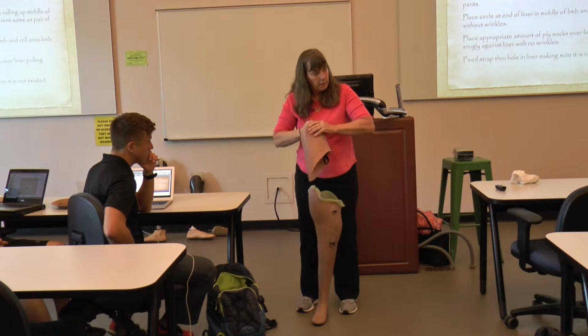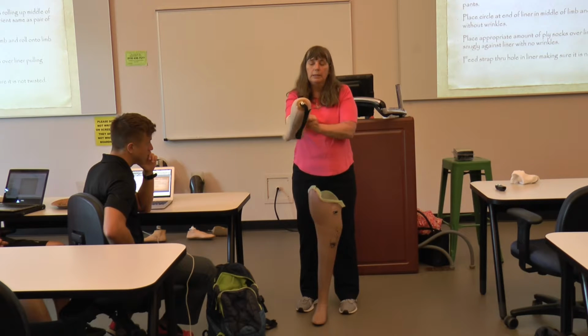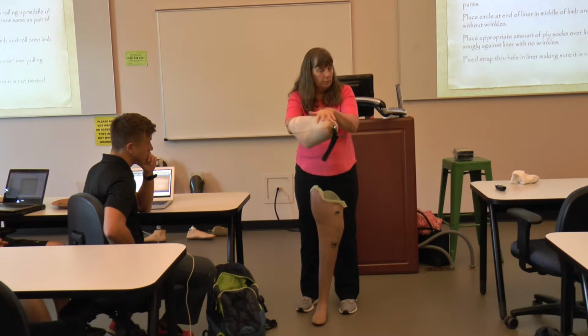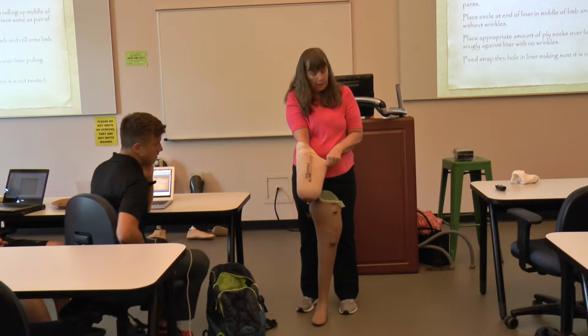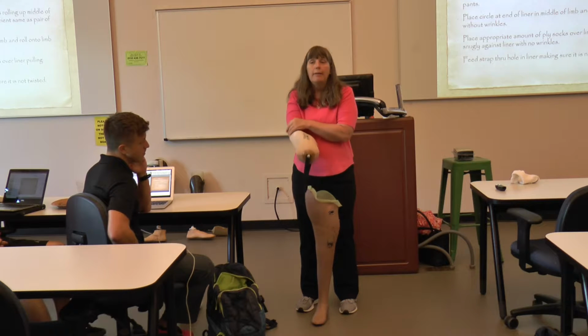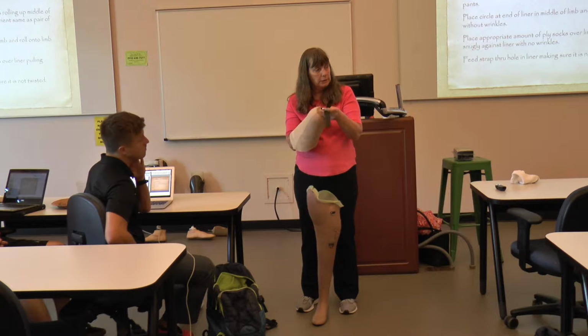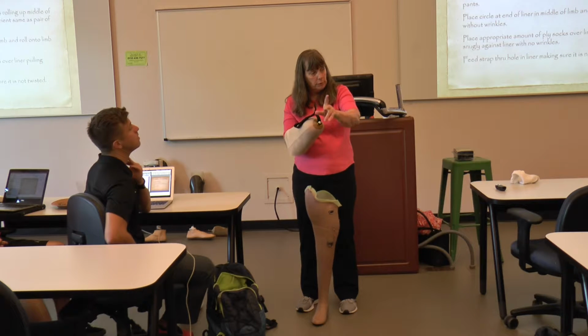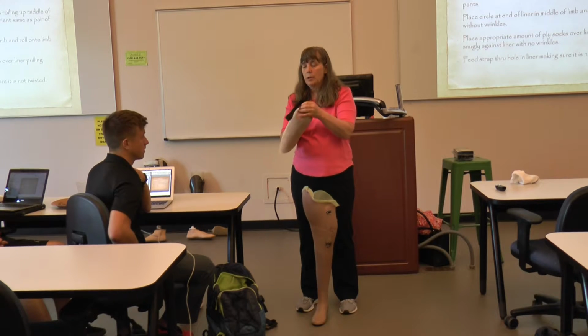I would roll it on. Ideally, when I get it rolled on completely, again, no wrinkles, I feel and make sure there are no wrinkles in it. This is going to be in my groin, and this is going to be up higher out here. At that point, I put on any socks that I'm going to put on. There's a hole in the socks, and you feed the strap through it, and pull the socks up snug.